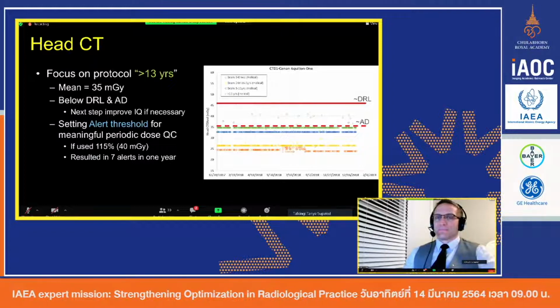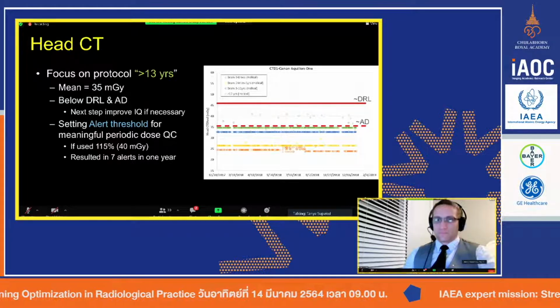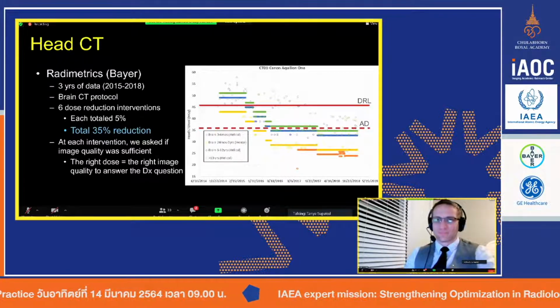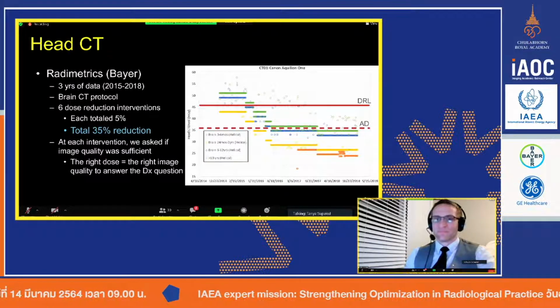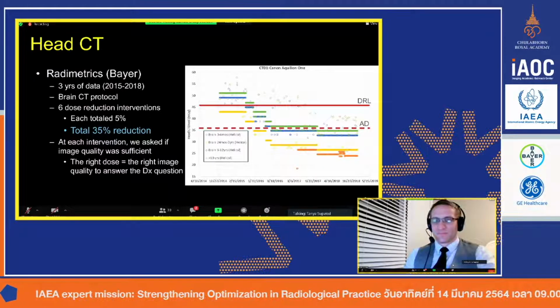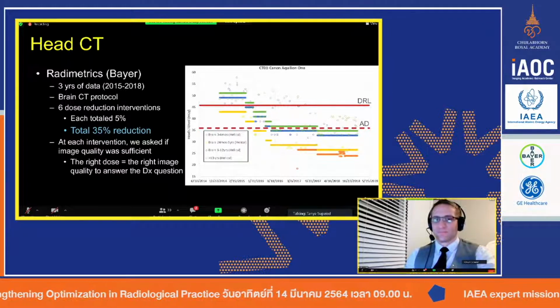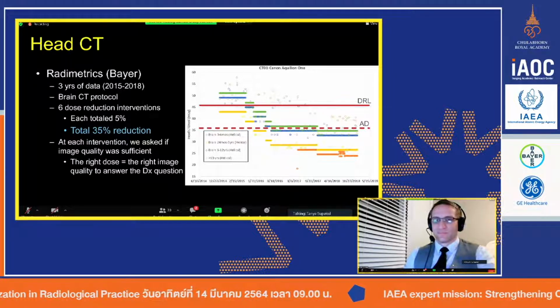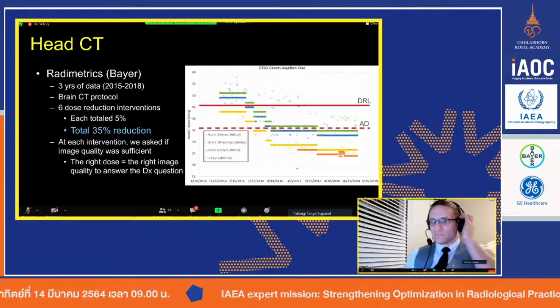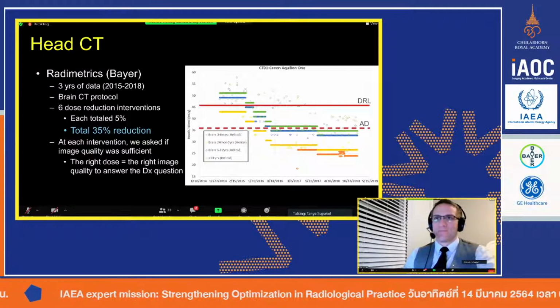And my last question is about the reduction that you mentioned earlier, which is stepwise: you know this level, now you try to reduce it a little bit and observe for a couple of months, and then the next step is to reduce further. Since for the brain, let's say for the CT head, we use fixed mA, helical mode, and we also use kV 100 for less than 2 years old and 120 for more than 2 years old, what can you reduce? Fixed, so you just adjust the mA a little bit at a time, right?